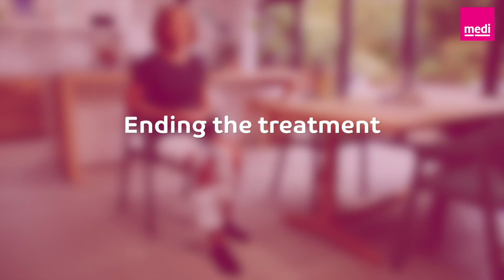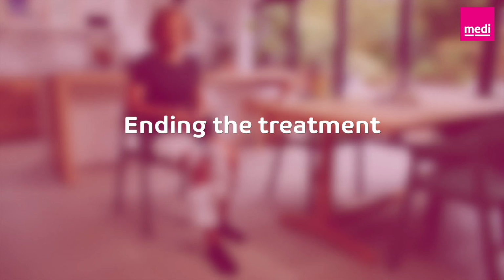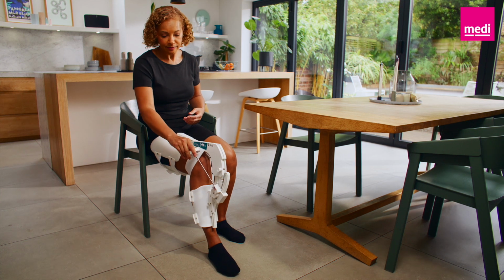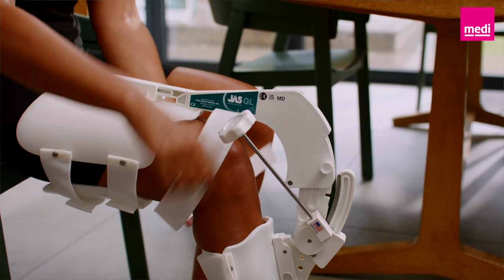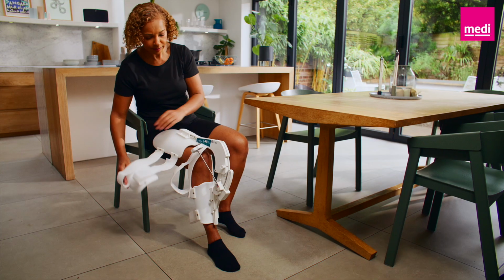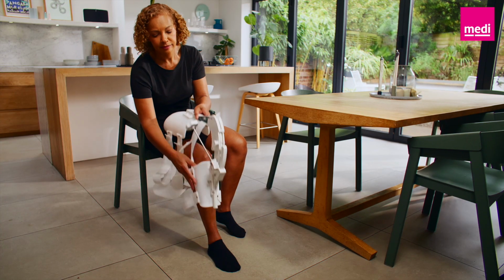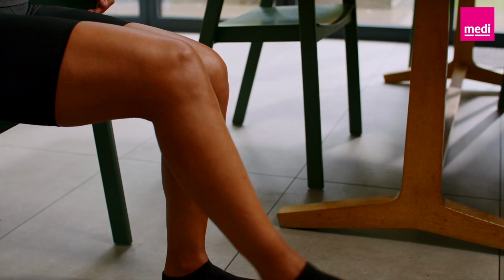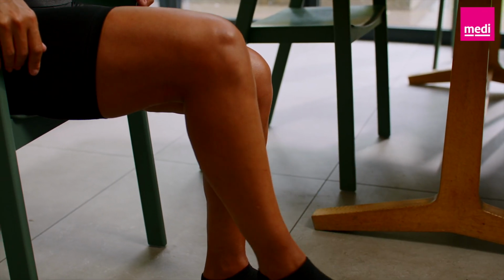Ending the treatment. After you've completed your 30-minute treatment, carefully turn the therapy knob to release the stretch and unfasten the straps. Gently remove the brace from your leg. It's common to feel some joint stiffness following your JAS session. To relieve this, gently straighten and bend your leg.